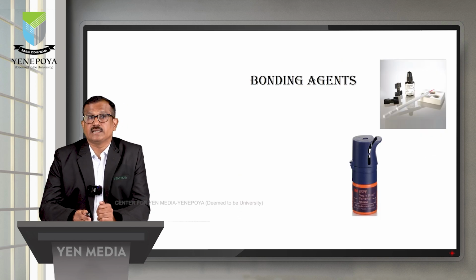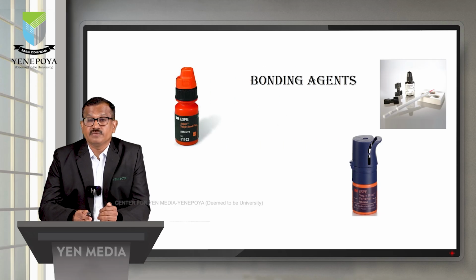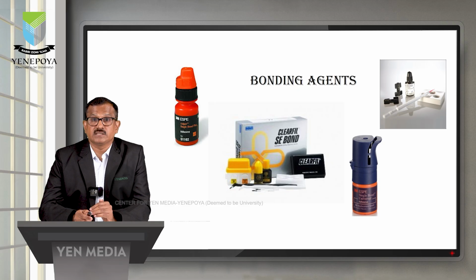That's what I understand. So now, bonding agent: we have different generations, as I said, 5th, 6th and 7th. You can choose as per your knowledge, your inventory, affordability and things like that. The case also matters. In some places where you think it is deep enough, it is better not to etch there, and the choice would always be the self etching type.